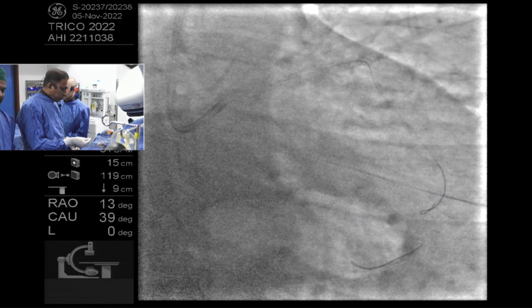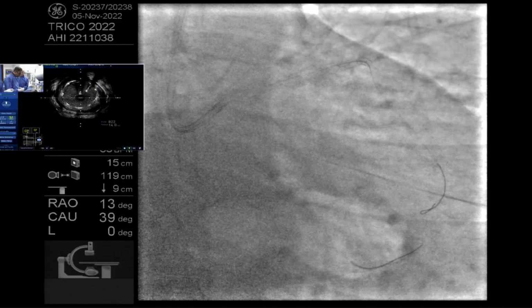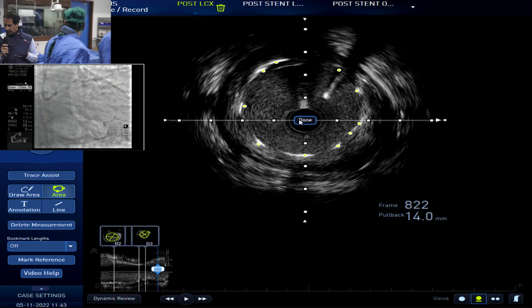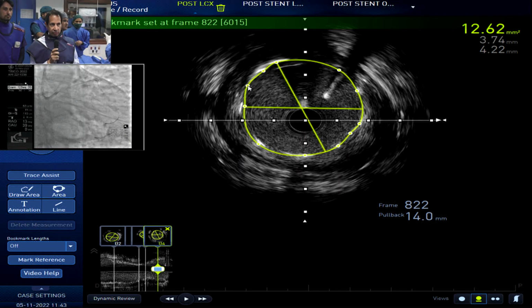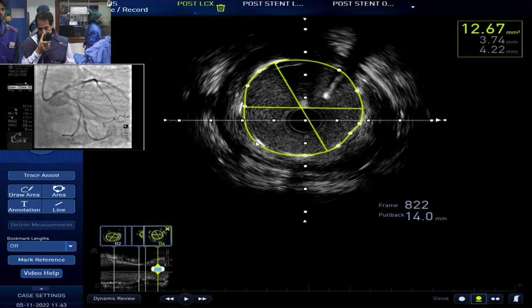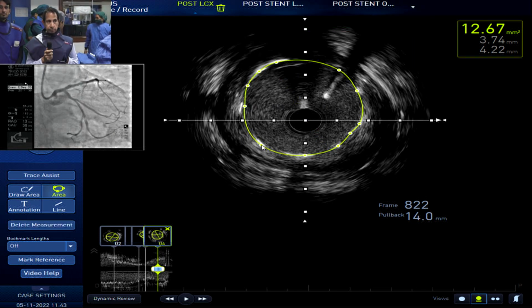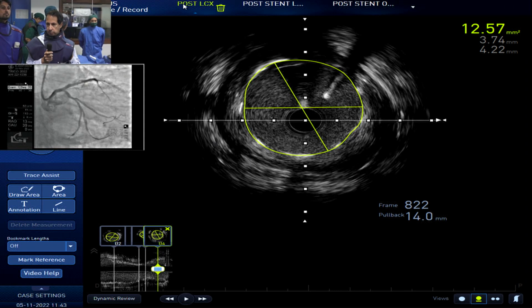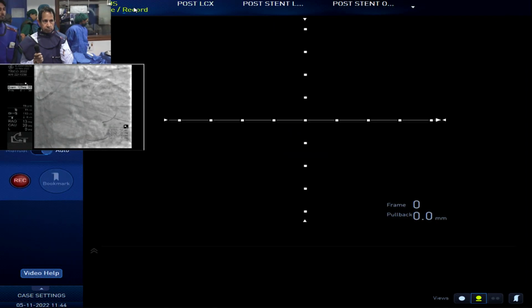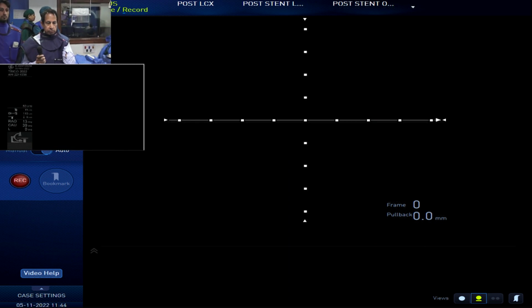So on the panel, somebody mentioned repot. There was this debate, I know in Korea they showed some data that a final kiss was as good as a repot. Do you feel different on the panel? No, the previous IVUS run has also shown some malapposition proximally. Fine, it's time to have a repot after doing the final kissing before doing the IVUS.